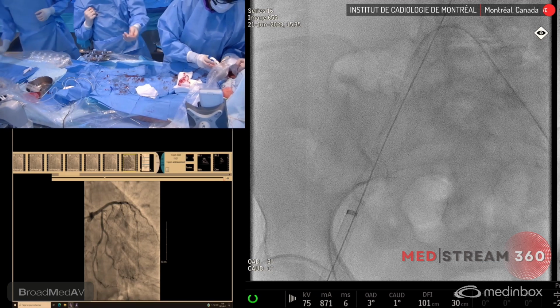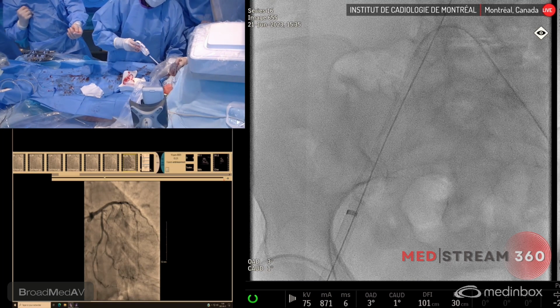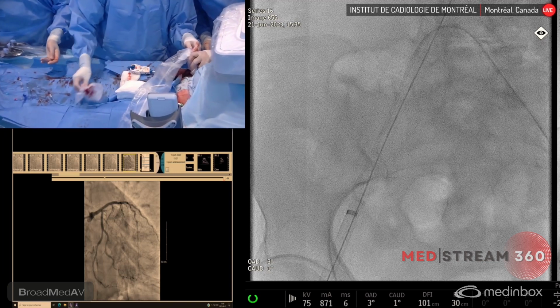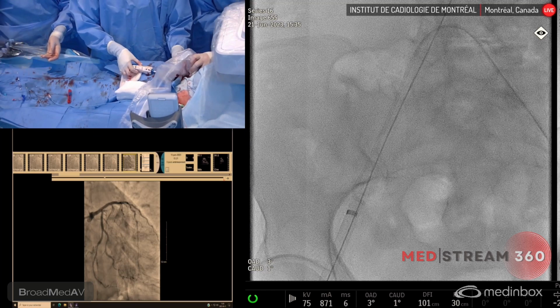Okay. All right. 45 degrees. Pulling out. Green, blue. Green, yellow. No. Collagen is down. Yep. Okay. Let's see in cross section if we see the results. We can show. Yeah, so you can see the collagen plug.